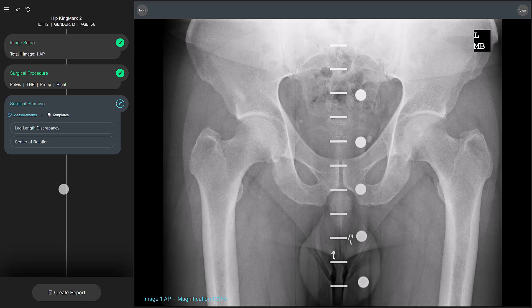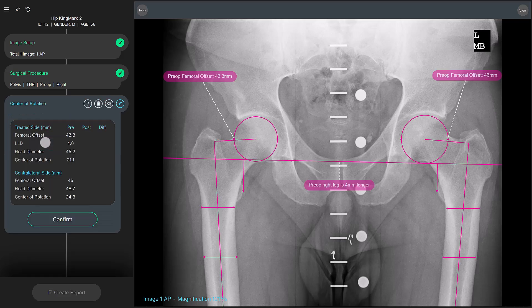Once you select the center of rotation tool, TraumaCAD NEO automatically places the tool on the image and positions it. The cup size is determined based on the diameter measurement of the femoral head. Use the markers to adjust the tool to the reference points.